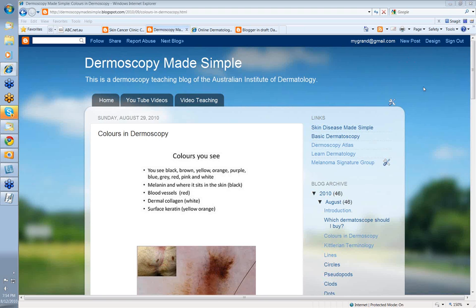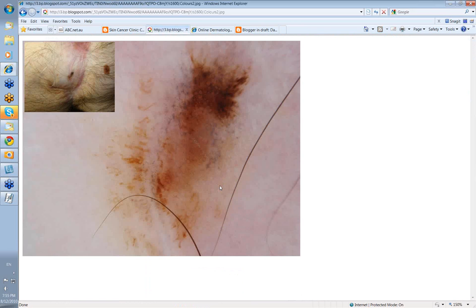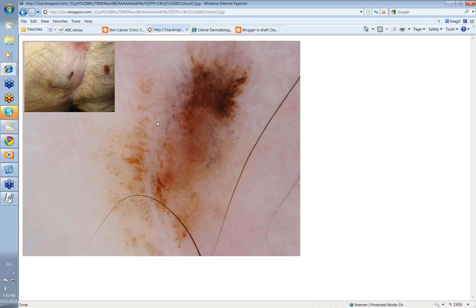Colors are an integral part of what you see through a dermatoscope when you look at a lesion on the skin. Looking at this lesion here — it's actually a nevus that's been transected when a person had a surgical operation, this is a surgical scar — you can see the variety of different colors: black, brown, a reddish brown, grey, some orange, more grey scattered, and a bit of white where the nevus has been transected. It looks quite worrying, but transected nevi often do look worrying when they come back in a scar line. But it's colors we're concentrating on tonight.